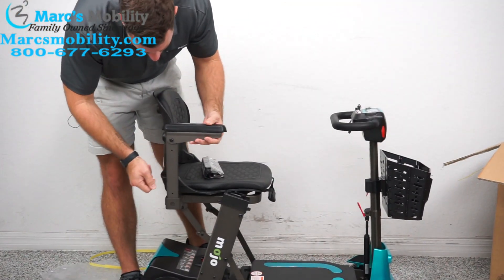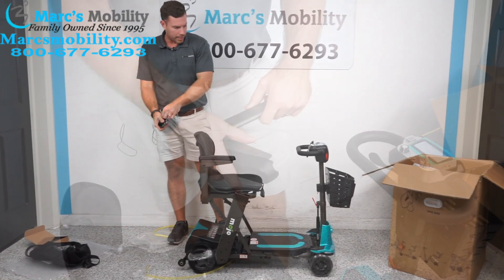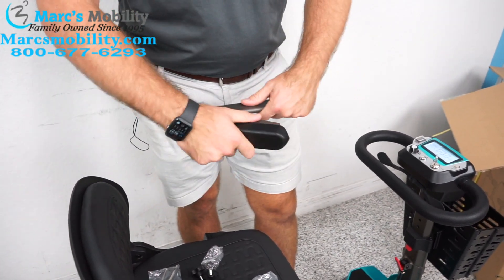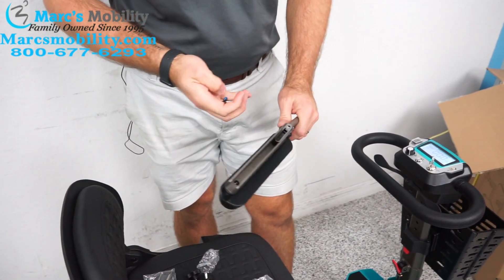There are some tools and screws that they provided. We'll put these in and be right back. With your armrests, they're going to be folded up like this. You'll see there's no way the armrests would stay level like that. If you open up your armrests, you'll see a threaded hole.